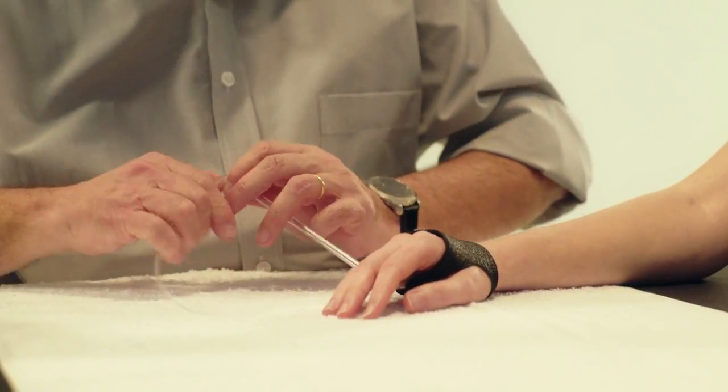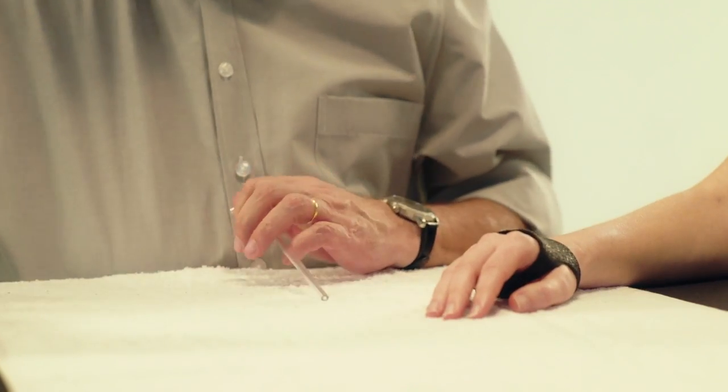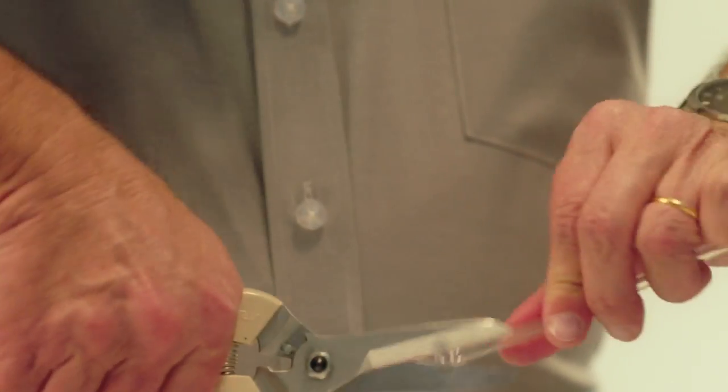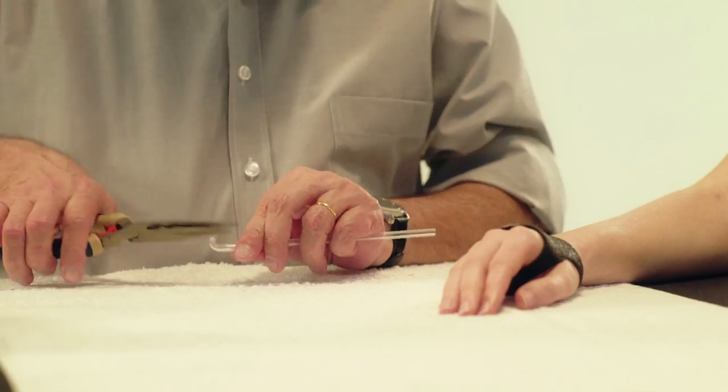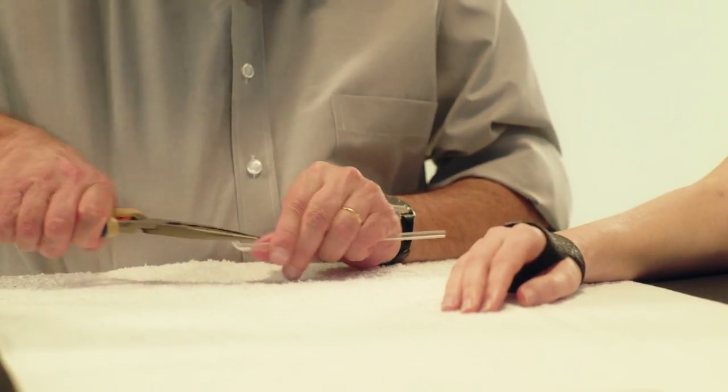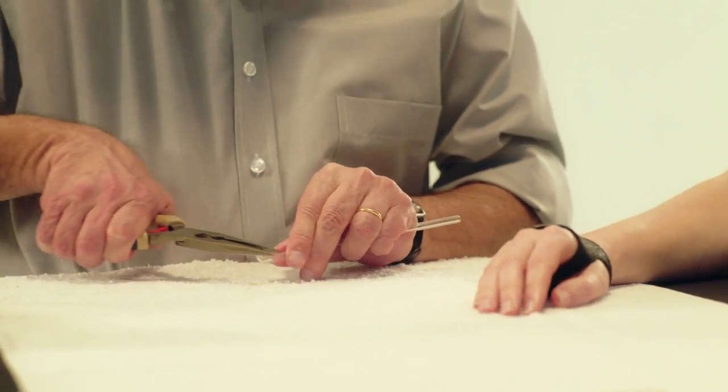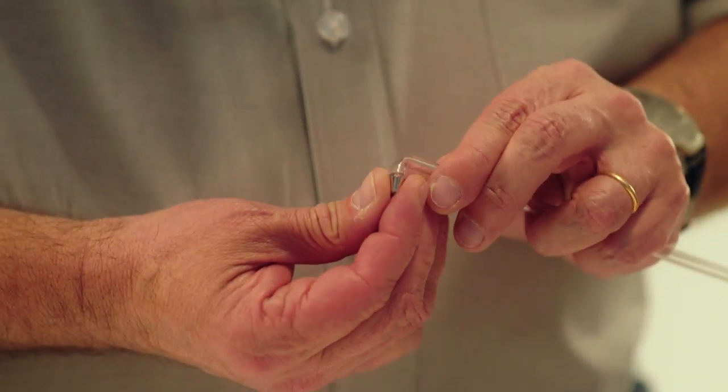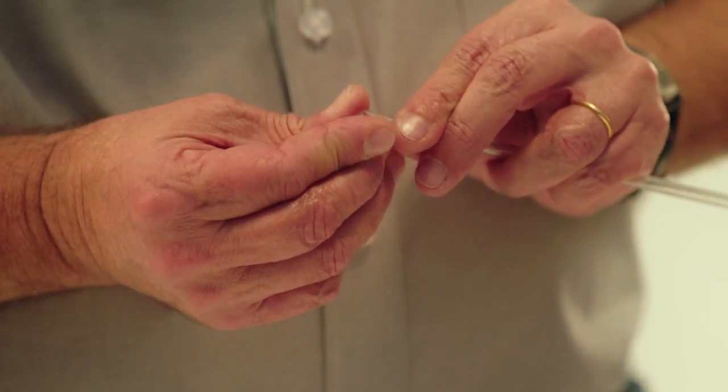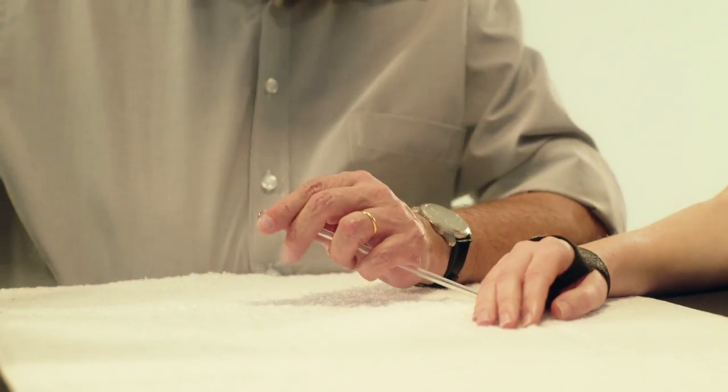Angle the Orphi tube using strong pliers, remove the guide and cut away the excess material. Deburr the sharp cut edge of the Orphi tube. Attach an Orphi tube end cap to avoid friction between the elastic thread and the Orphi tube.